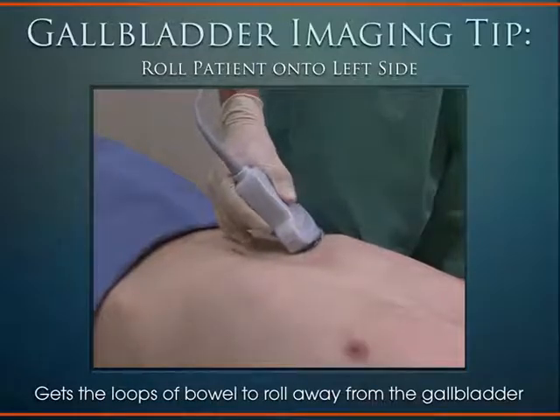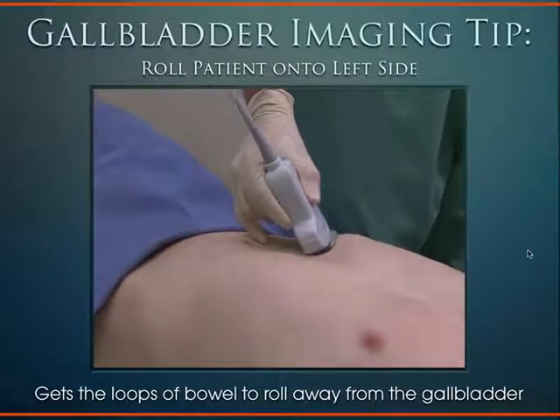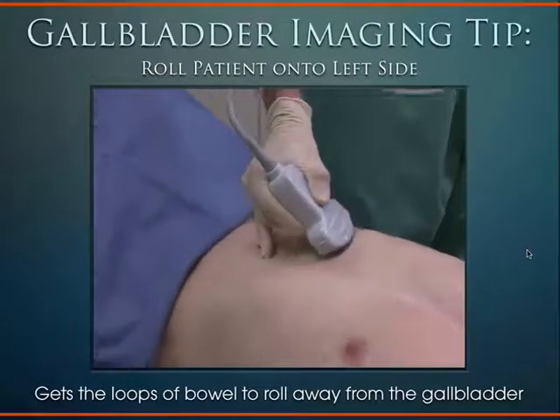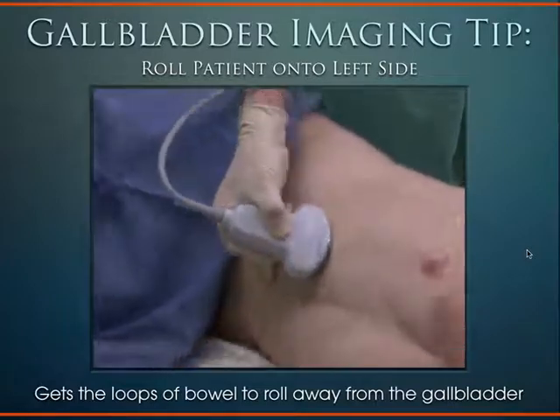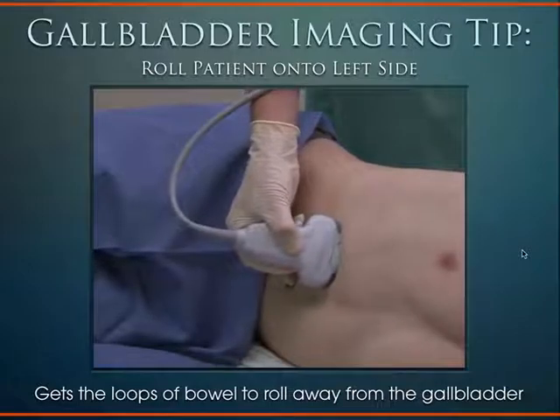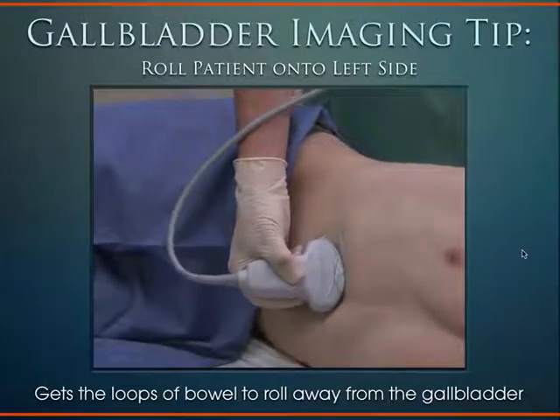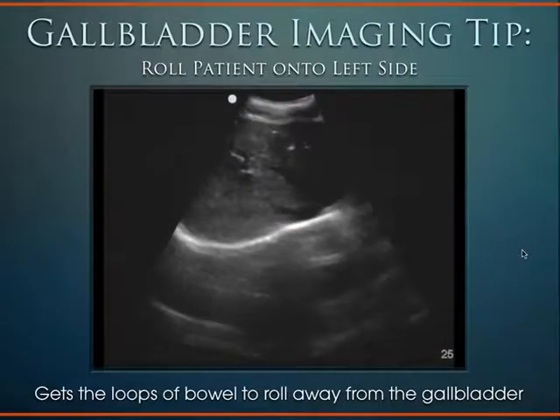So it really does help to roll the patient on the left side. Here we are trying to get the view, and we're having a tough time. And so as we roll the patient off to their left, now we get some of those loops of bowel to fall out of the way, and the gallbladder can be much easier to see. That's a big trick that I use whenever a resident is struggling with the gallbladder.